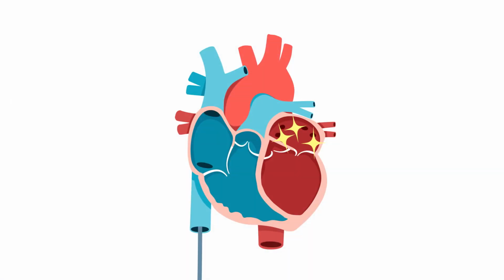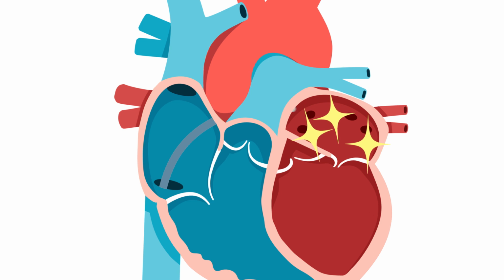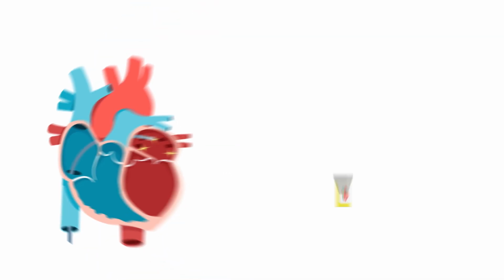The energy delivered via these catheters reduces the ability of small areas of heart tissue to conduct electricity. For the treatment of atrial fibrillation, these applications of energy encircle the regions where the atrial fibrillation originates from, thereby electrically isolating the problematic tissue from the rest of the heart.